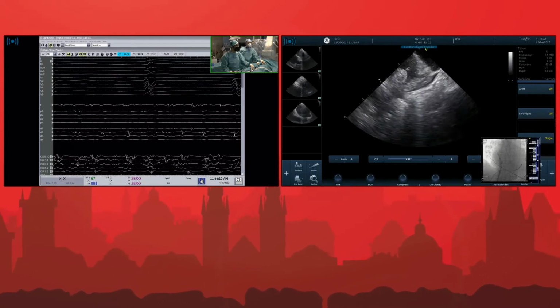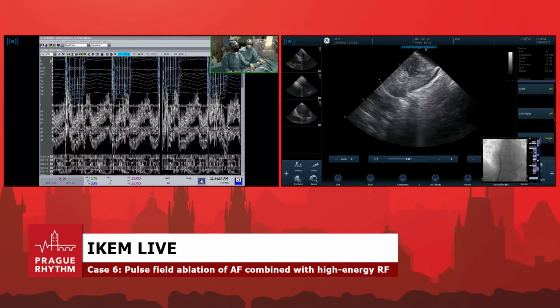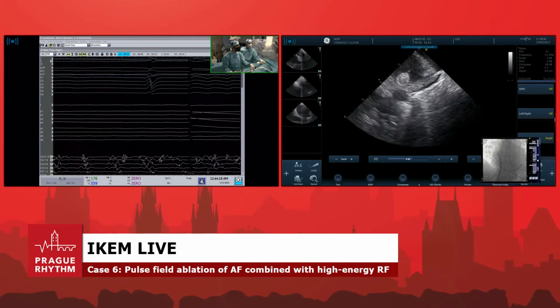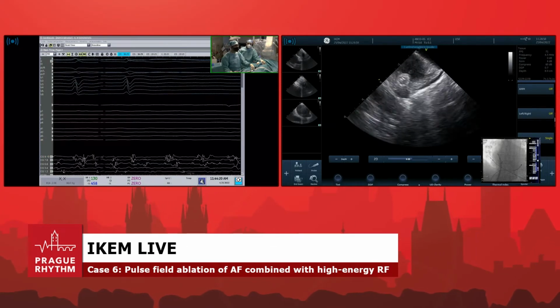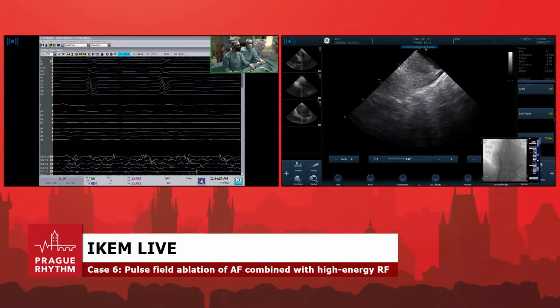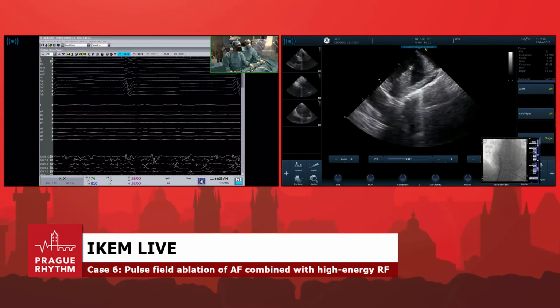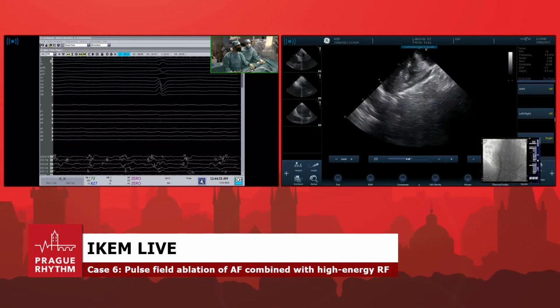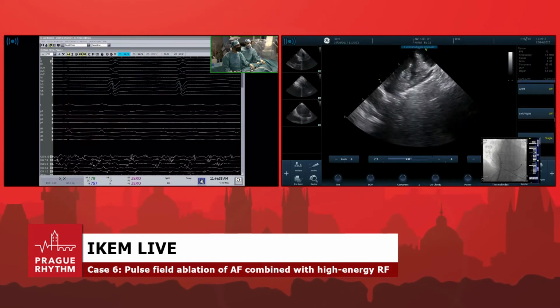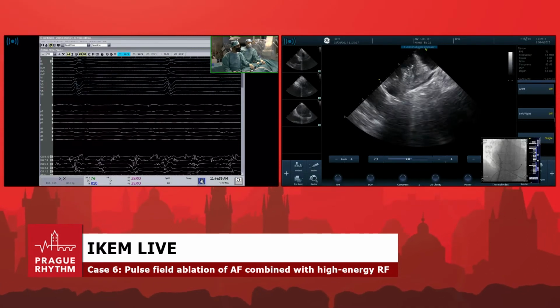Okay, so we're going to apply the first lesion now. So remember those electrograms before ablation. And let's look at the electrograms after ablation. And they are gone. You see, even when I move like 5-6 millimeters, this is 6 millimeters away from the first lesion, there's still no electrograms. Now, when I move like 8-10 millimeters, you start to see electrograms.